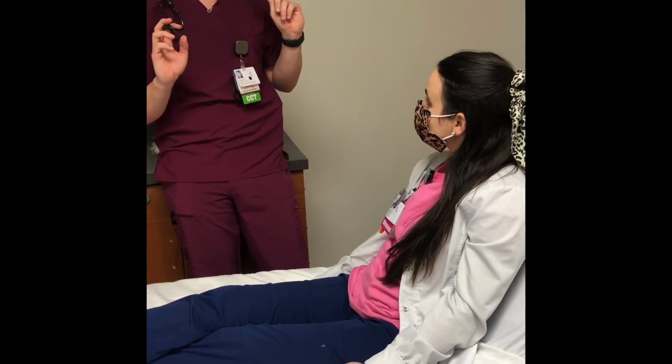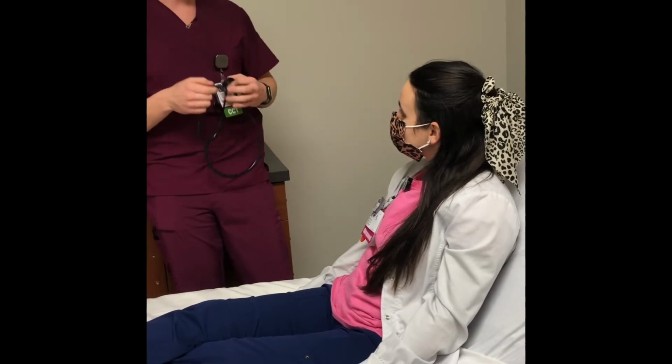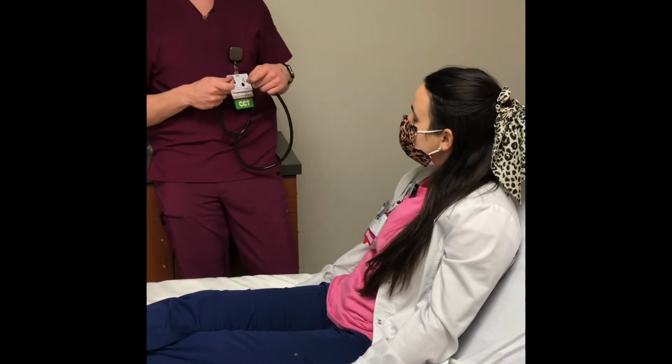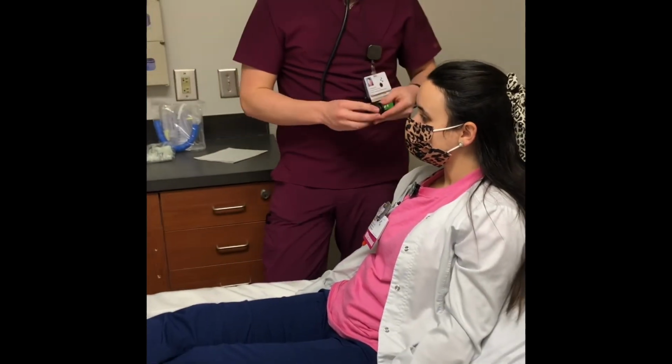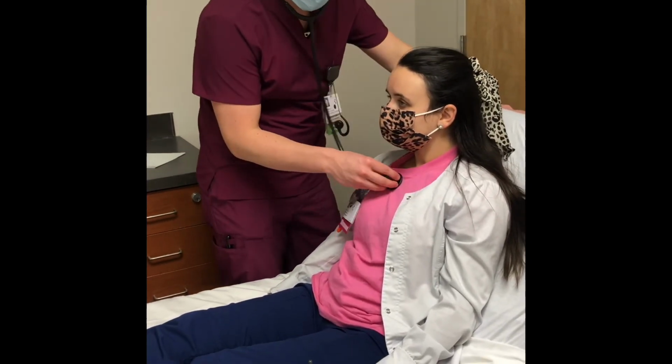And lastly, I'm going to go ahead and start with your cardio assessment. So do you have any chest pain, any heart palpitations, anything like that? Nope. Everything feel normal? Mm-hmm. All right, sweet. So the first one, I'm going to go to the second intercostal space.